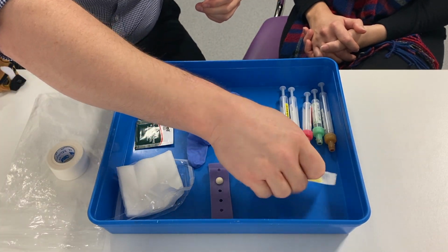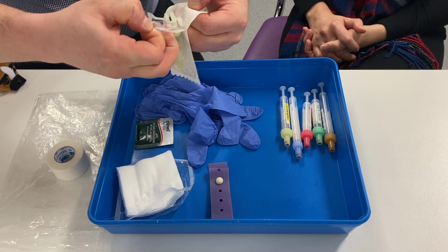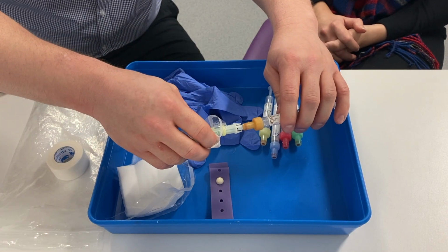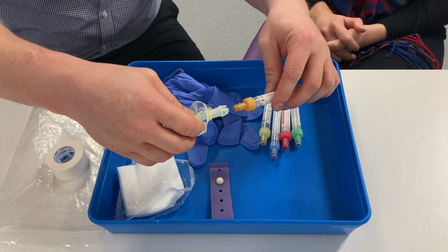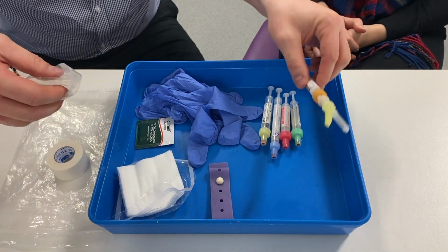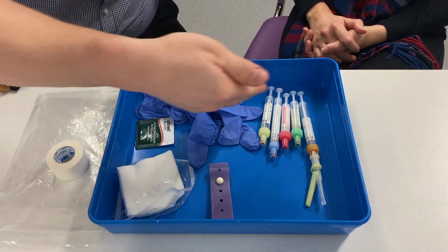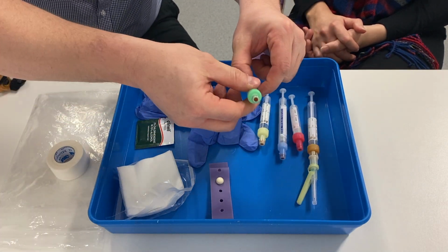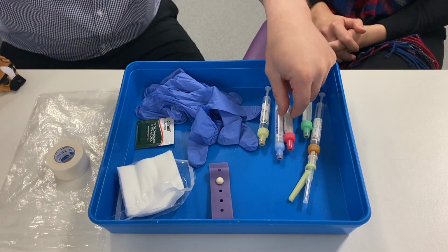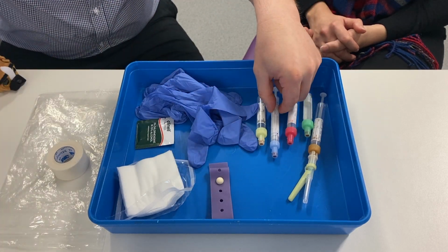I would then also be mindful of my needle so I don't contaminate it. Open up my needle packet and connect my first bottle, which would be the brown bottle if I'm thinking about the tree, brown of the trunk, onto the needle, and make sure it's in place. The brown bottle, the first bottle will remain unvacuumed, but all the next bottles after that, I can pre-vacuum these bottles, so click and then snap all these bottles so they're all ready.